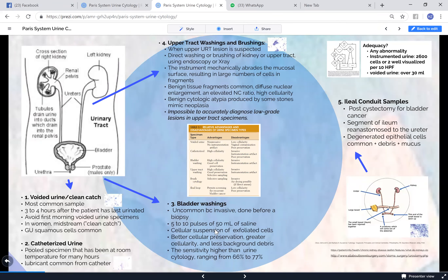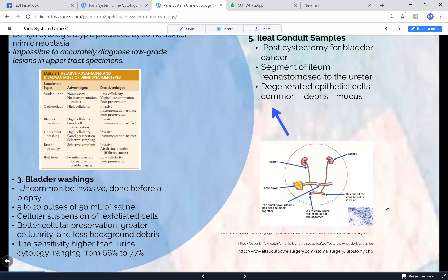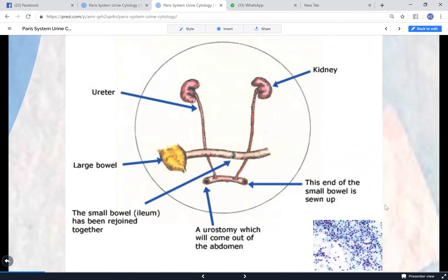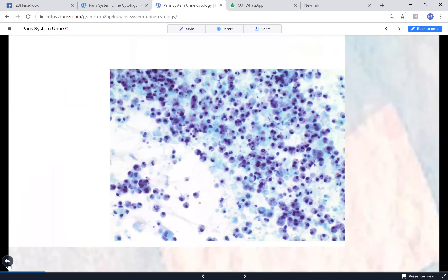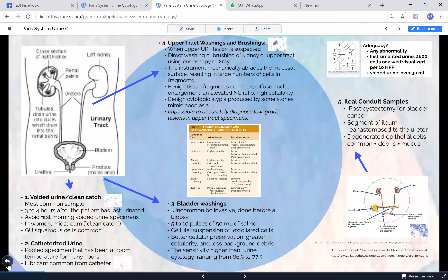Bladder washing is another instrumented specimen with better cellularity and cellular preservation, though it has the same instrumentation artifacts. The ileal conduit applies to patients who have had their bladder removed for invasive carcinoma - a portion of the ileum is used as a temporary bladder. It is very common to see degenerated urothelial cells along with intestinal cells and sometimes urostomy stoma adhesive material.